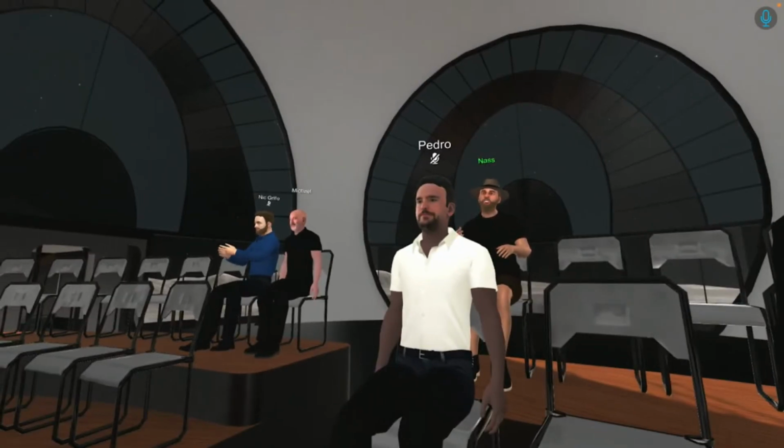But definitely to see abnormal vessels, it's better with the grayscale, and intraretinal leakage is best seen in grayscale too.